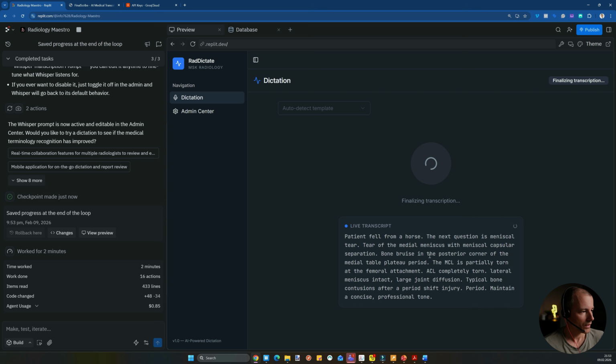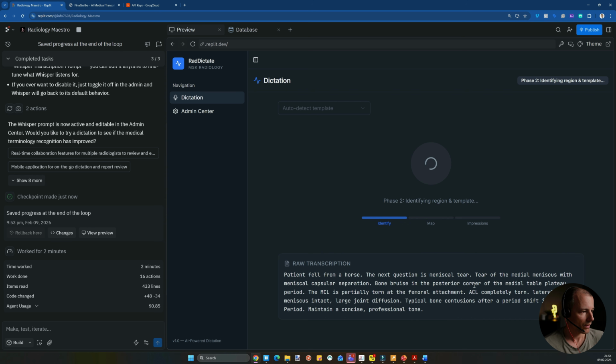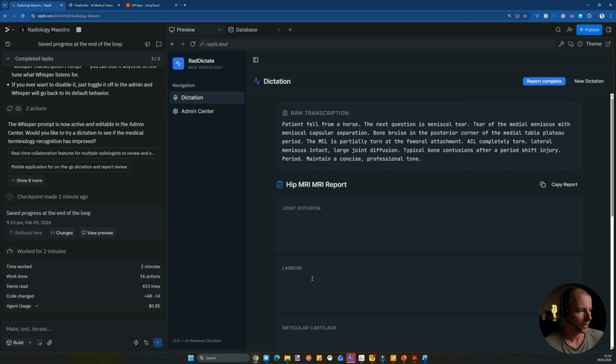Okay, so this looks pretty good. I like the speed, how it's coming. It's much better in recognizing what we are trying to say. It's amazing. I'm actually quite happy. And so we now have the raw transcript.